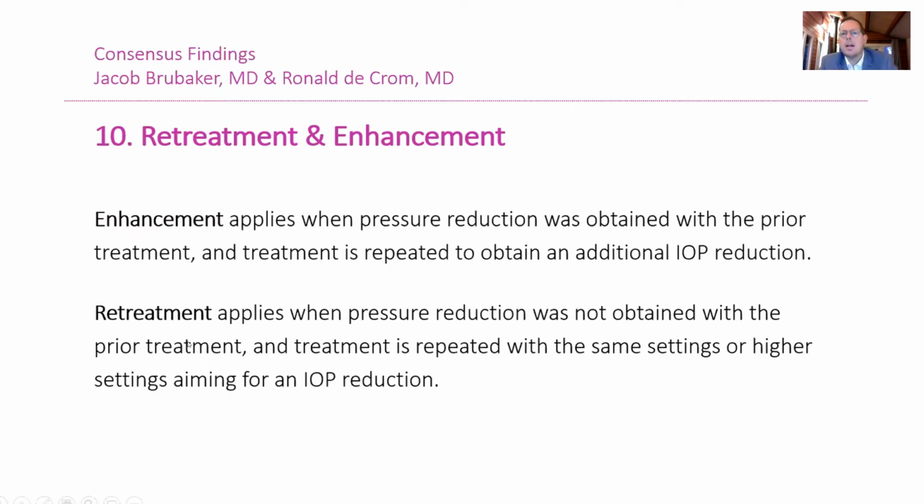Enhancement applies when pressure reduction was obtained in the primary treatment, and treatment is necessary and repeated to obtain an additional IOP reduction. Retreatment applies when pressure reduction was not obtained with the prior treatment, and treatment is repeated with the same settings or higher settings, aiming for an IOP reduction.